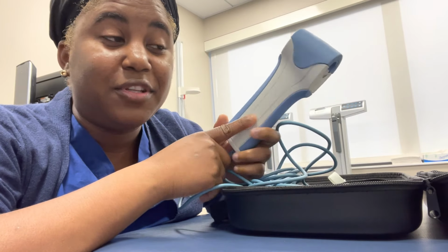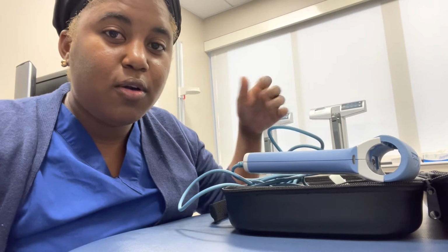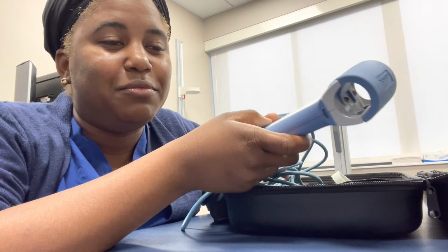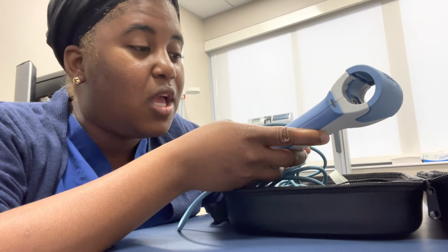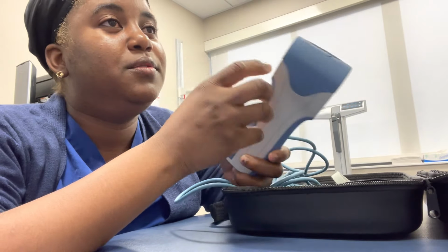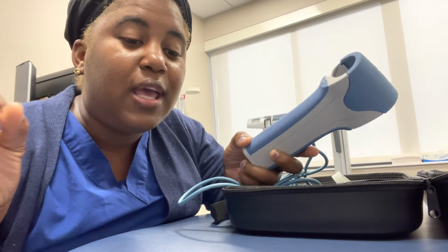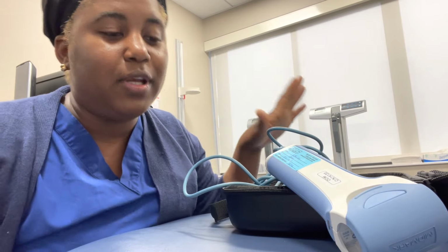And to help them blow out longer, we cheer them on. We're like, go, go, go, blow, blow, blow, keep going, keep going. Because this test can be hard, okay? Especially if you're out of breath. So you take a deep breath, put the thing to your mouth, and blow. And then you will see the candles blowing out. And if you can't go anymore, we're like, go, go, keep going, keep going.